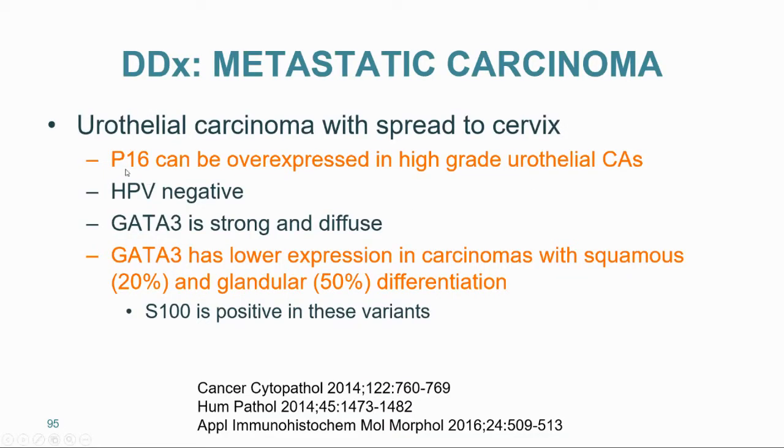Be wary of the fact that urothelial carcinomas can overexpress P16, particularly if they're high grade. If you have the ability of performing HPV studies, you can do them because urothelial carcinomas should be negative, although HPV positive categories also exist. And I'm not an expert on that, just for the record.